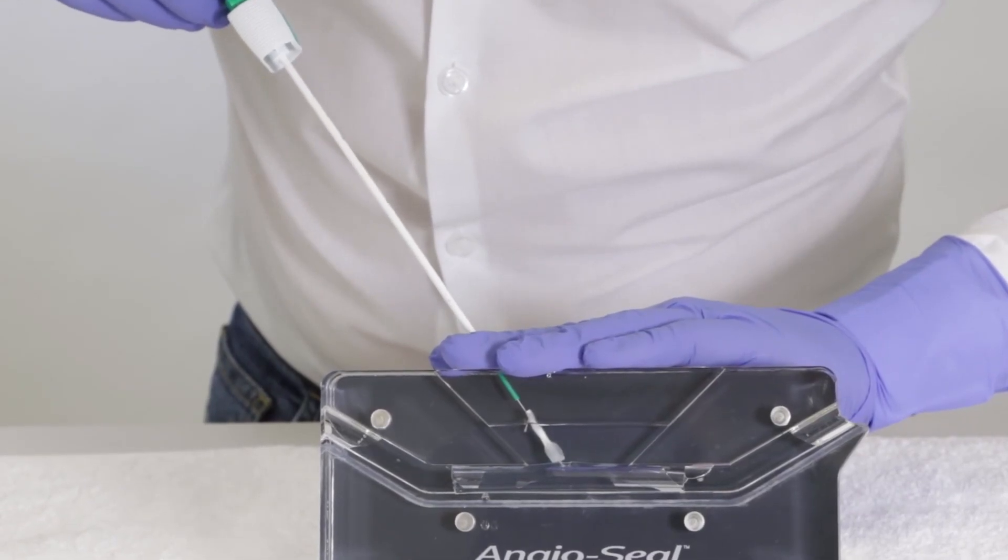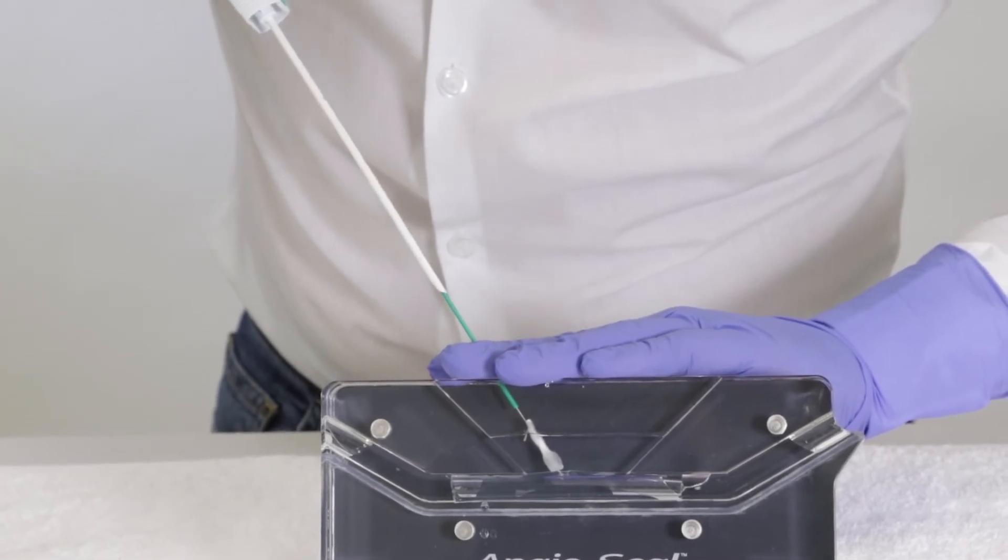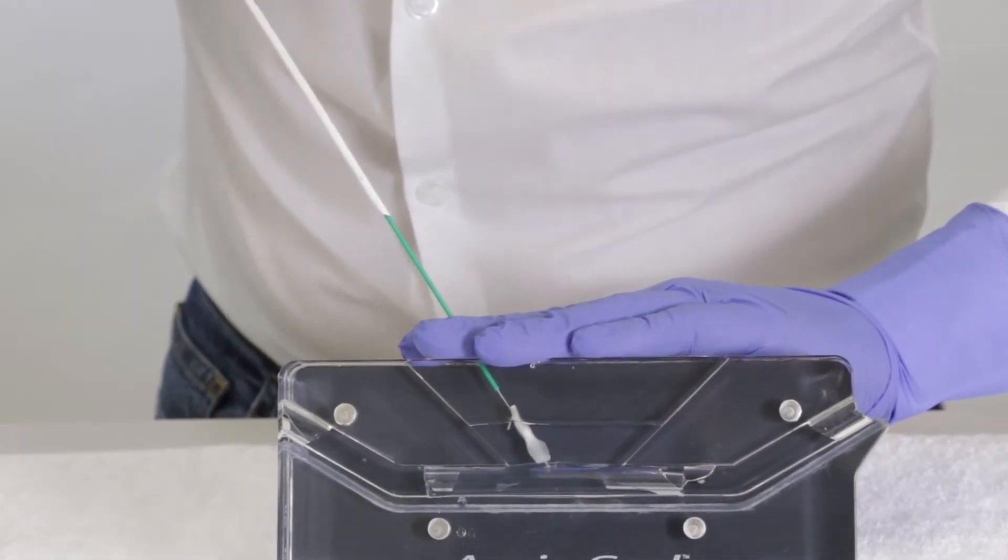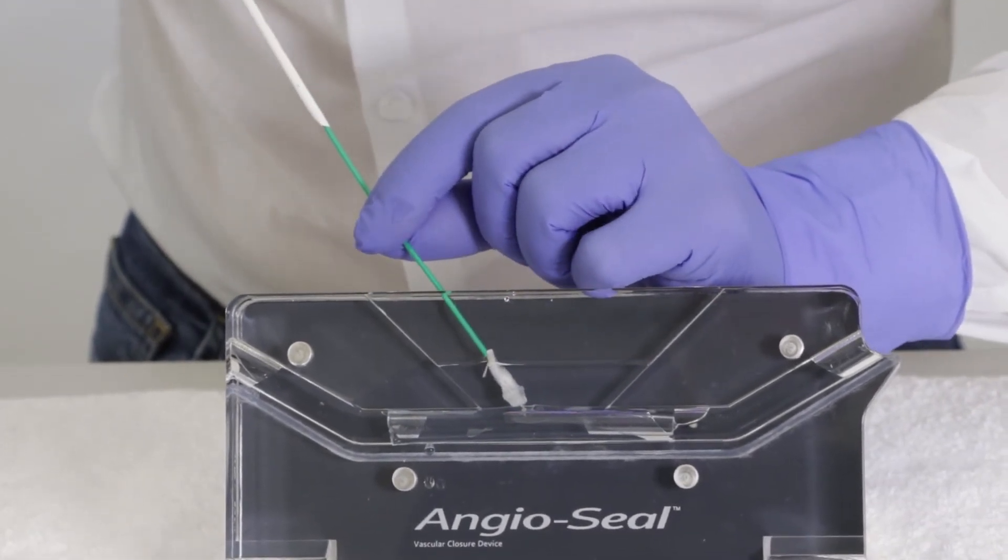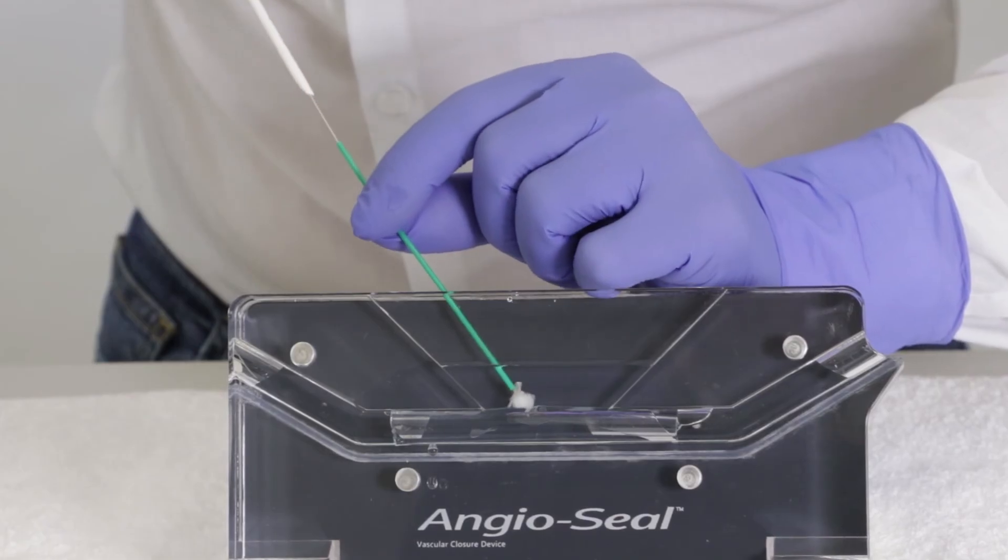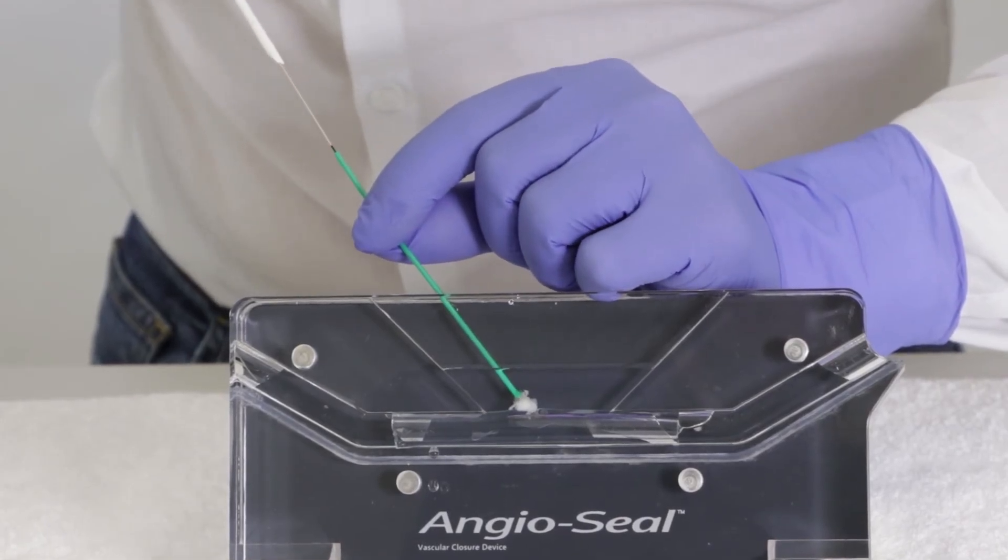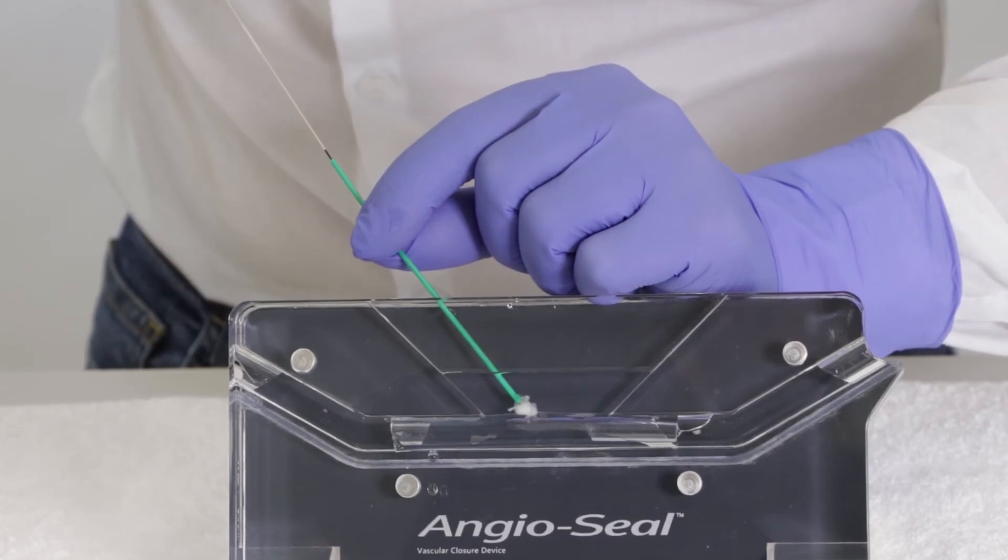The collagen expands in contact with blood and fluids, so in this case the water is doing that. You keep pulling and now the collagen is exposed and a green tube will appear. It's called the tamper tube. Gently push down the tamper tube to the collagen while always keeping tension on the suture until part of the black marker appears along the suture.